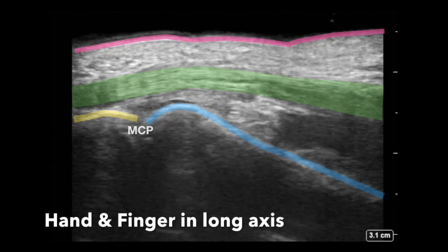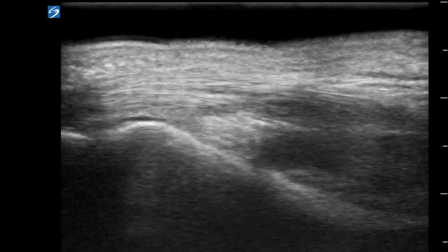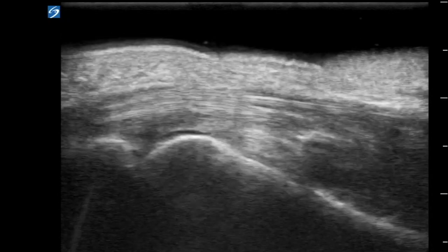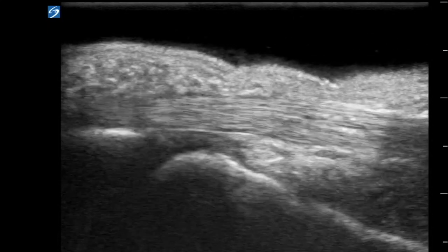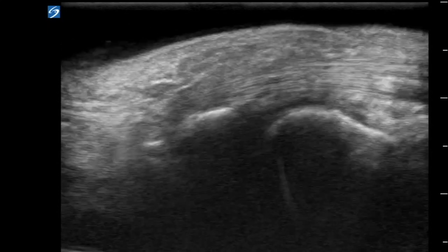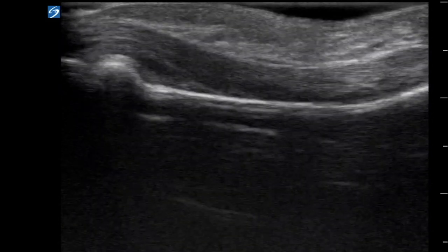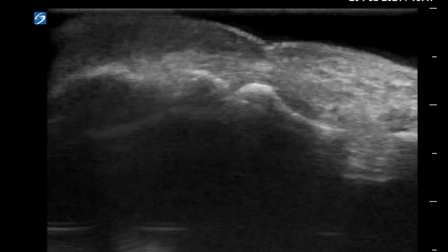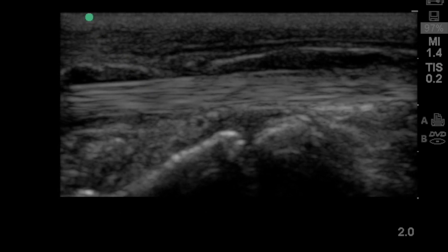To obtain the long axis, rotate the probe 90 degrees and you see the flexor tendon with fibers in long axis in green, the metacarpal in blue, and the proximal phalanx in yellow — making it the MCP joint. You can now slide the probe towards the fingertip and have the patient flex their fingers to demonstrate the flexor tendon moving back and forth, going from MCP to PIP and then to the DIP.